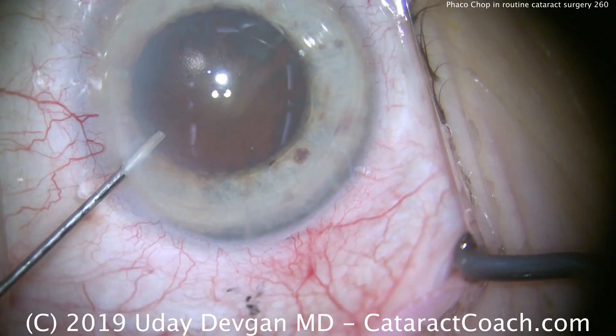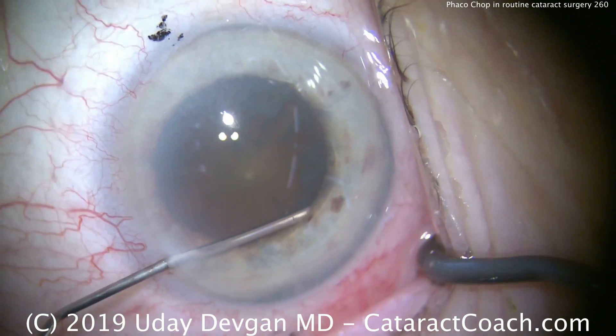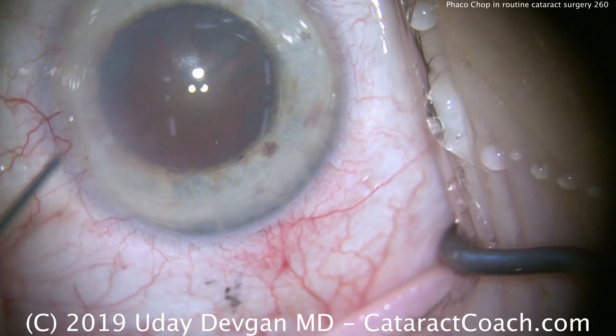I'm going to start off the case by putting anesthetic in the eye. This lidocaine has some epinephrine in it as well, which does help to dilate the pupil. There are various mixtures of this available, or you can certainly mix your own.